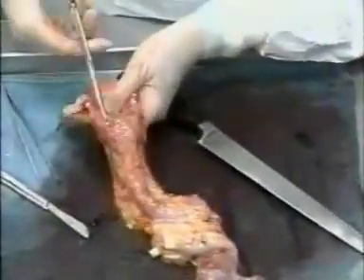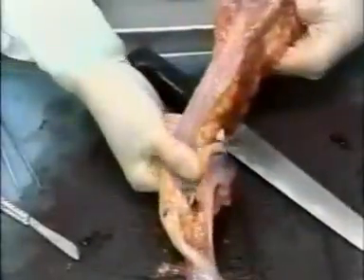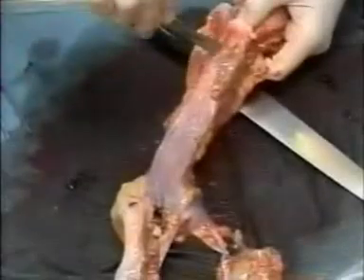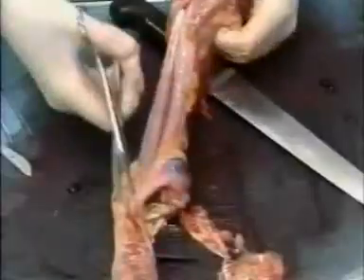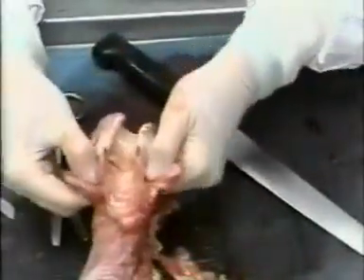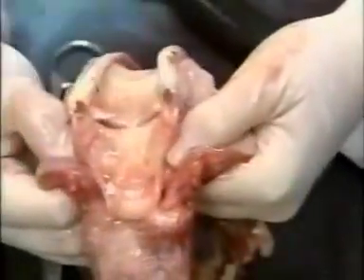Okay. First she'll open the esophagus. And you can just see a normal-looking mucosa, no foreign bodies. Next, she will open the larynx and trachea. And again, a very normal-looking appearance. And those are the vocal cords there and there.